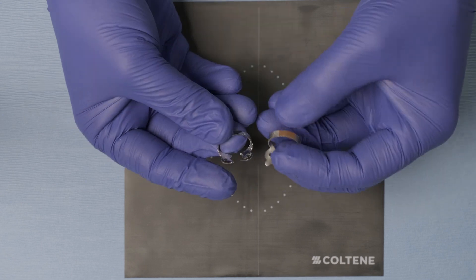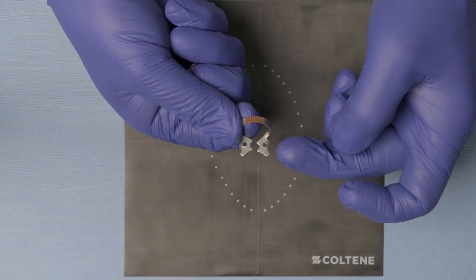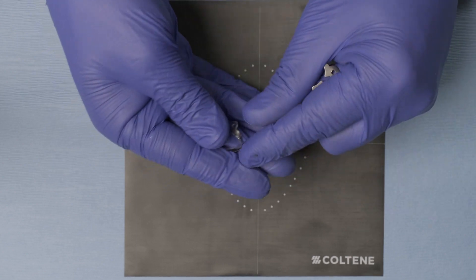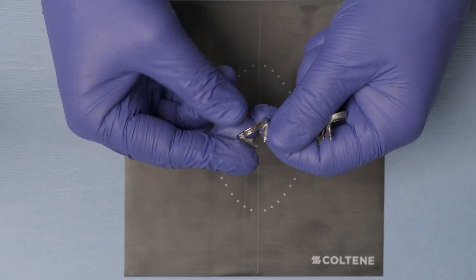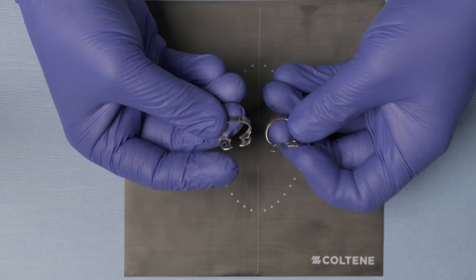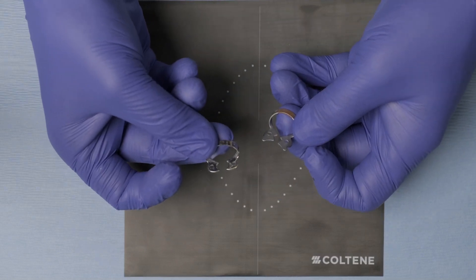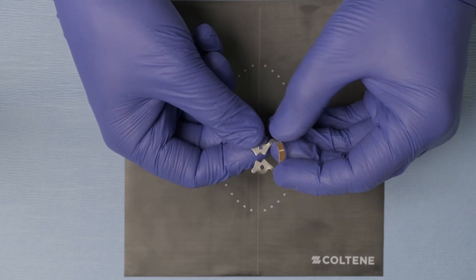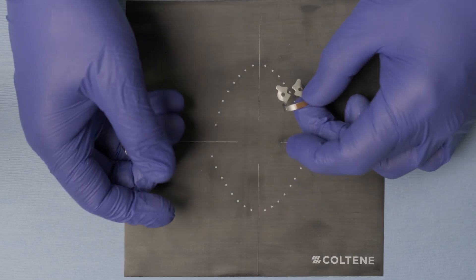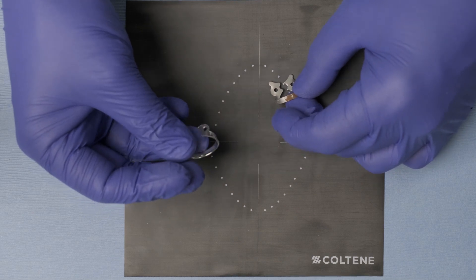There are two different types of clamps. You have the wing clamps, like the number two clamp, or you have the wingless clamp, like the W2 clamp — W standing for wingless. For operative dentistry, you're normally going to use a wingless clamp. But the wings on a wing clamp are actually made to make it easier to attach them to the rubber dam.